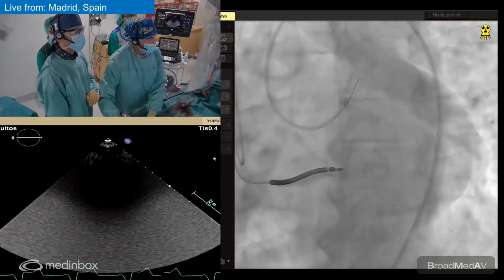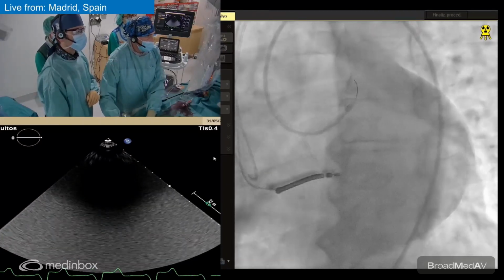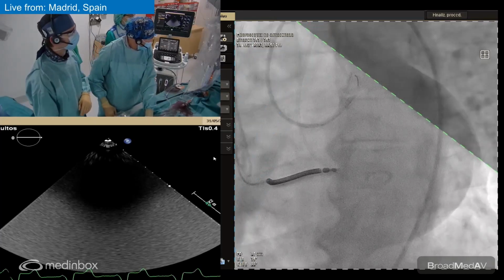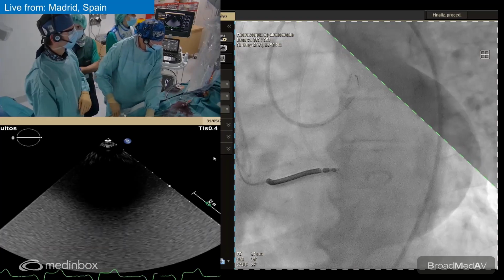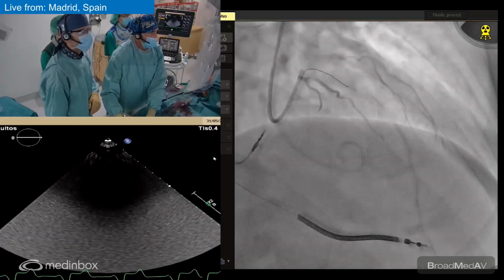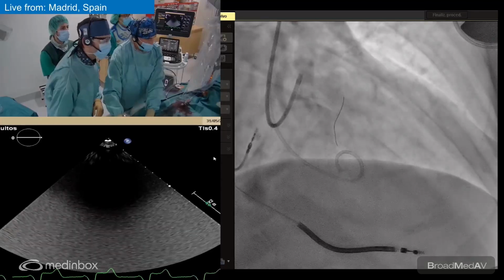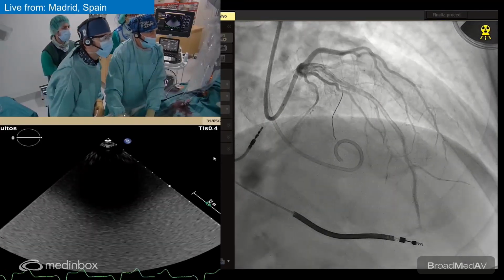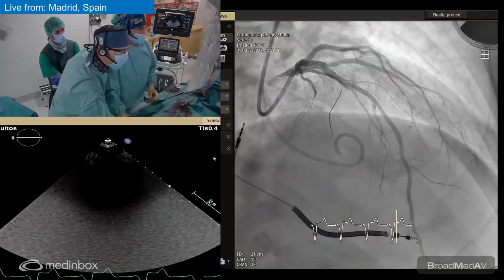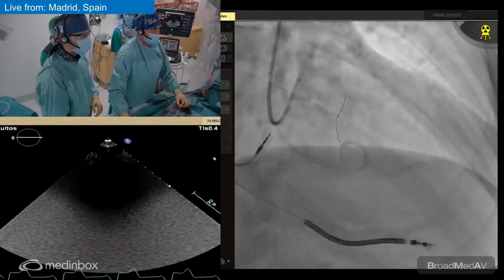There you are. Okay, so the diagonal. Is this one, no? You can do a cine when you are there. Is it okay? Yeah, I think so. Because there is no flow now in the septal, probably because it's so tiny. Yeah, it's this branch. Okay, perfect.